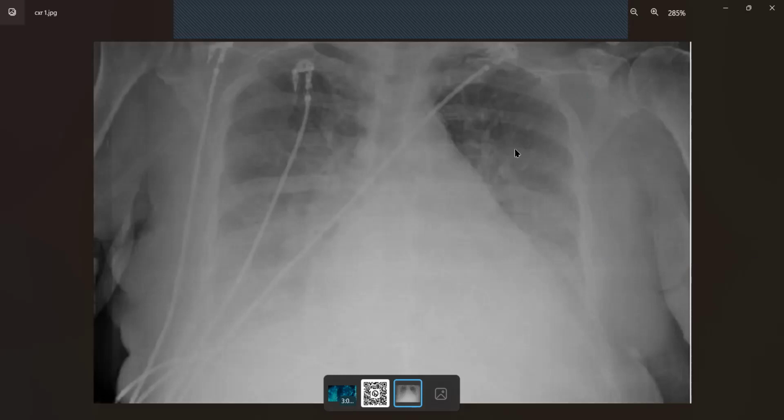So actually, I found a lovely X-ray that I was going to share with everybody, just to give you a little bit of background on something that we sometimes struggle with. In this case, this was quite an obvious patient, with severe limb swelling, pitting edema, raised JVP, and hepatomegaly. It came in also with shortness of breath, was known with hypertension and congestive cardiac failure, and presented to us. So it's quite an obvious finding of congestion, or let's just say pulmonary congestion, pulmonary edema.